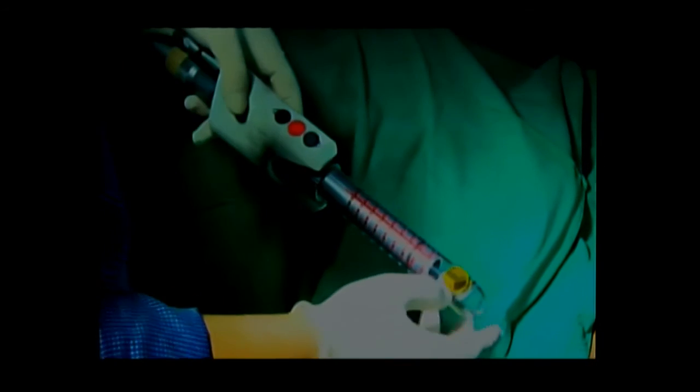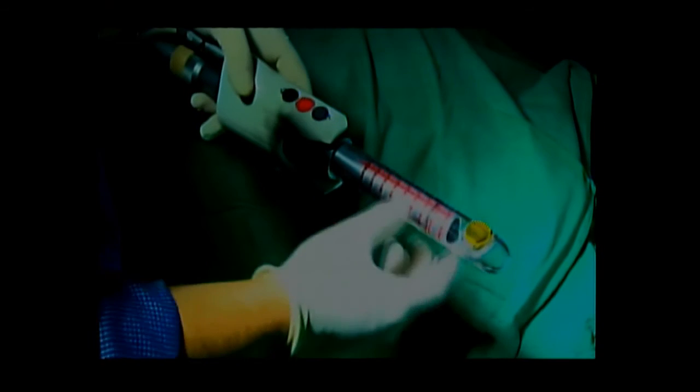Now it's very important to ensure that the window is right across the lens, because otherwise we don't transfer directly the beam of the laser. So it's very important to ensure that the window is above the lens. And then we put the protector.